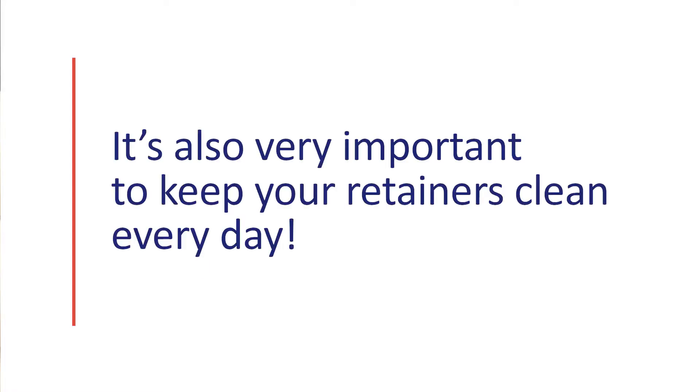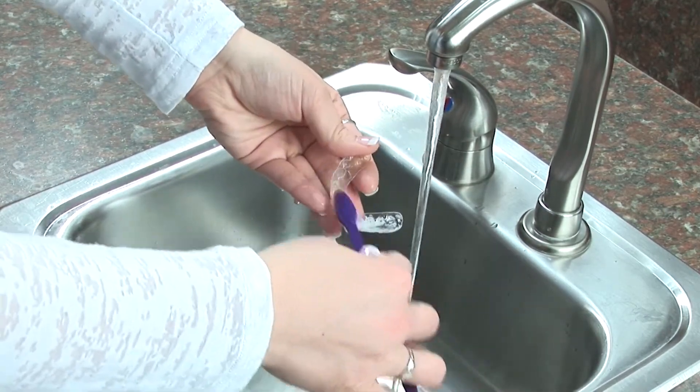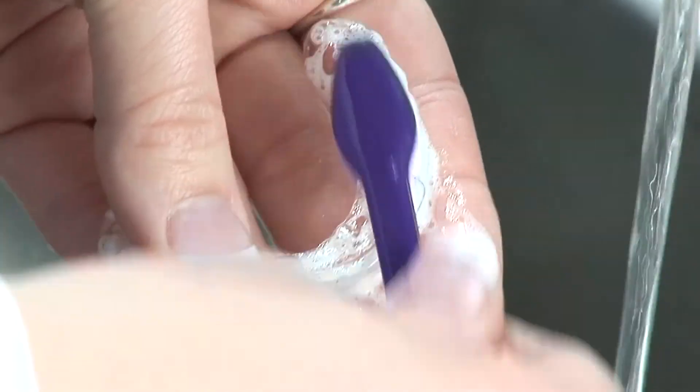It's also very important to keep your retainers clean every day. If you have what's called an Essex retainer like this, it's very easy — just use a toothbrush and be sure to brush the retainer thoroughly.